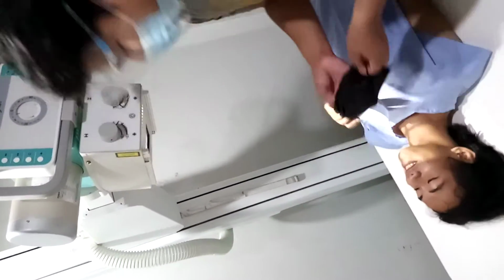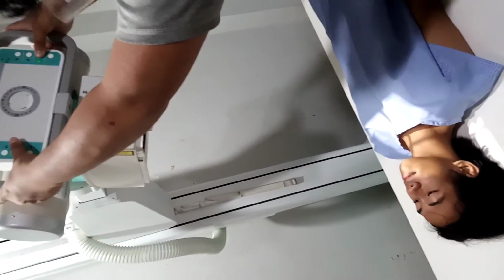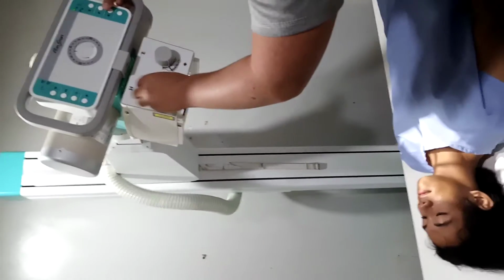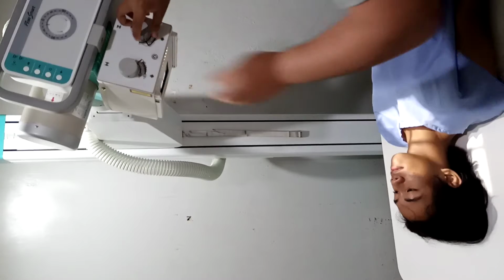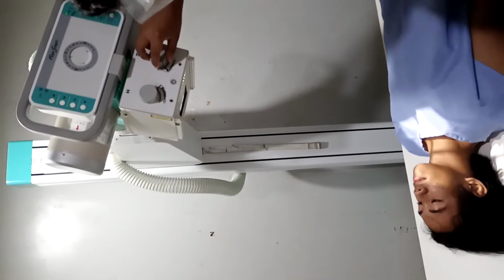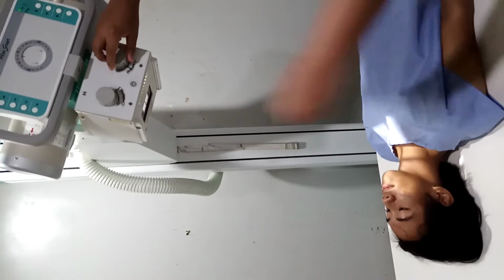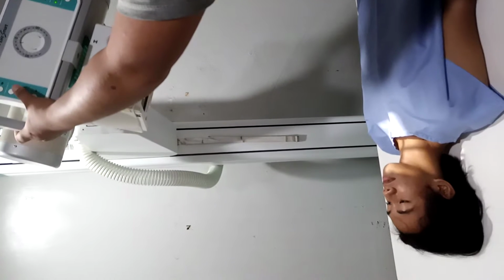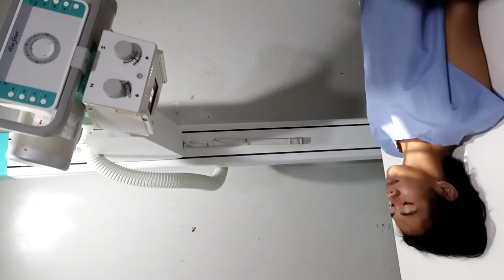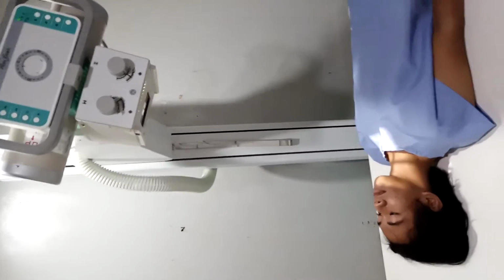Face mask, please, sir. Just cephalad, 15 to 20 degrees. In this demonstration, we use 15. And collimate at the level, collimate at the extension. That's our AP axial projection.